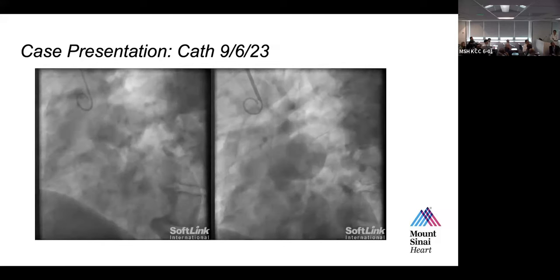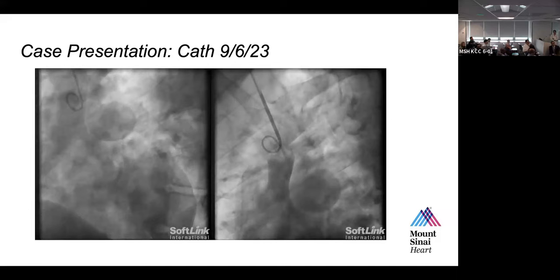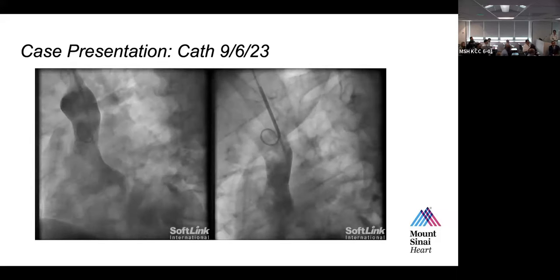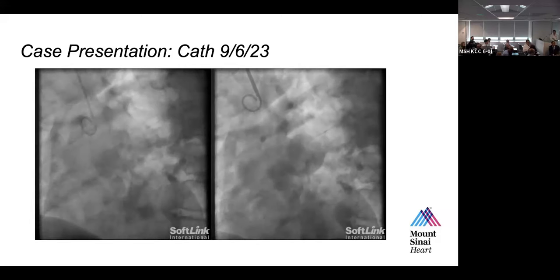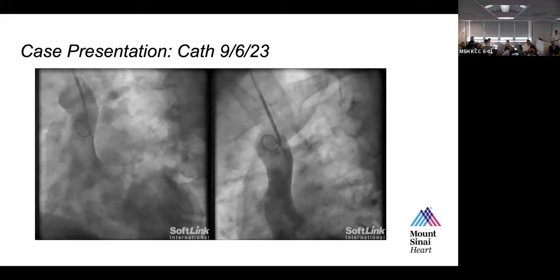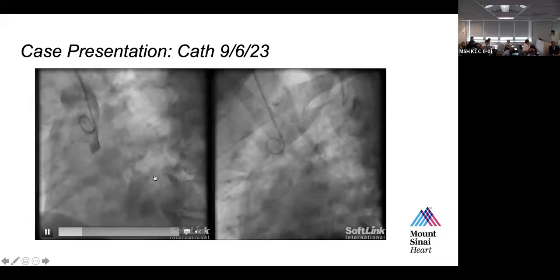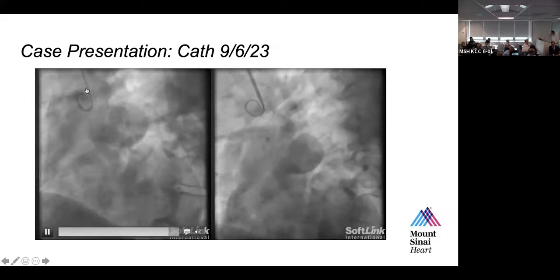So there you go. So we need to obtain a complete angiographic view, right and left, recalculation of the shunt, as well as possibly evaluate the length, azygos and down, of the SVC in order to contemplate the possible transcatheter options, if any. So, clearly very well substantiated for that.